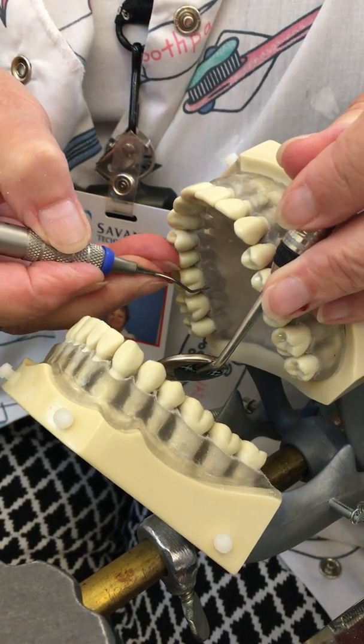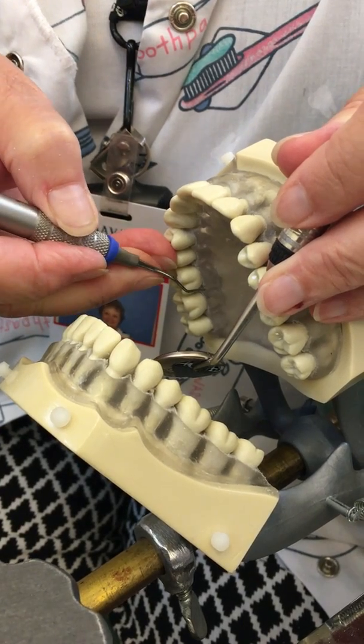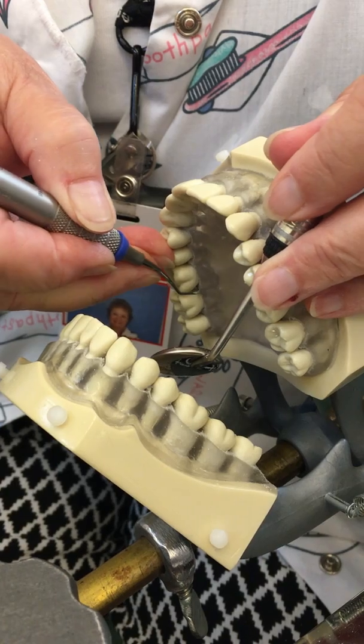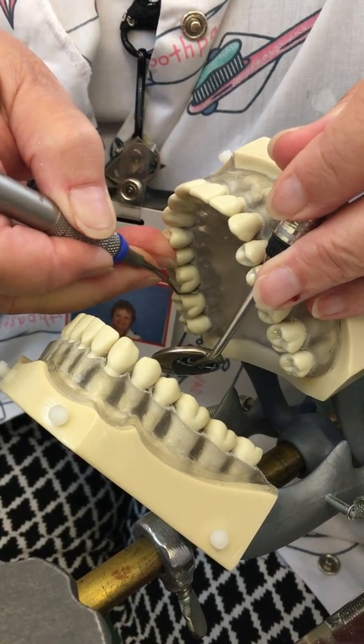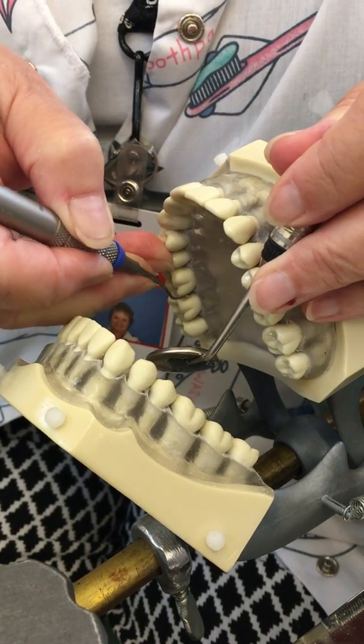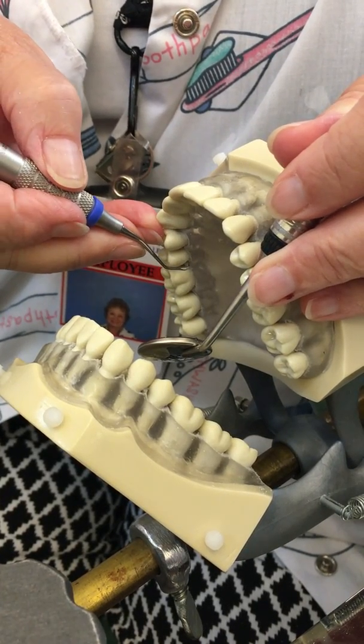We'll go in closed and then open. The terminal third of the cutting edge is on the tooth at all times. So it's toe to tooth, toe to tooth, toe to tooth. That means you're rolling that instrument every stroke toward the tooth.